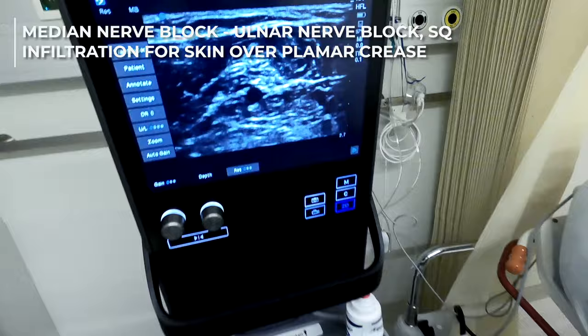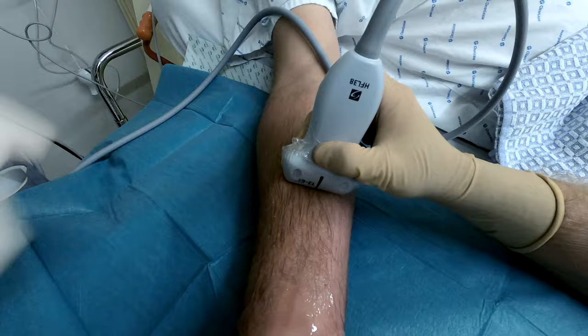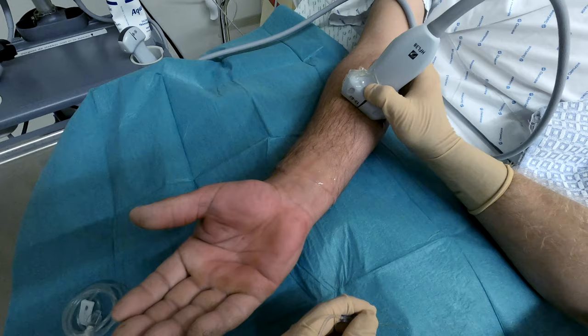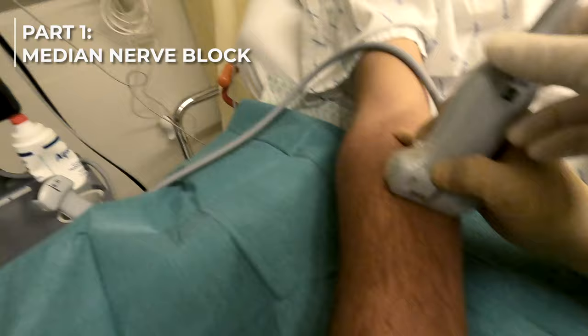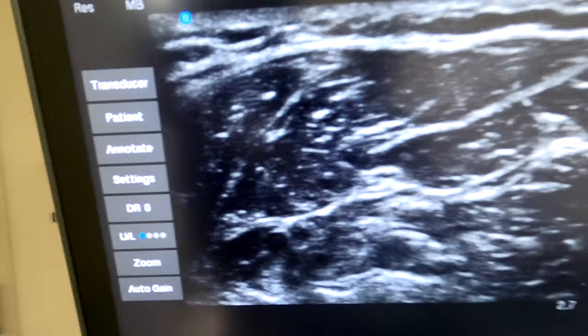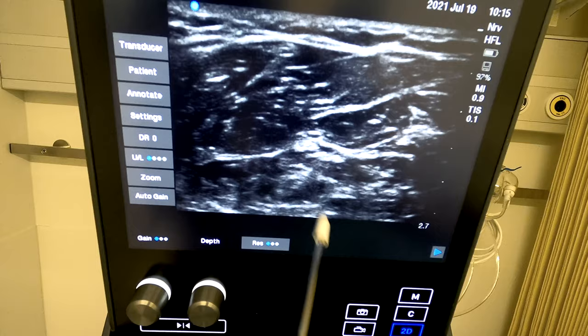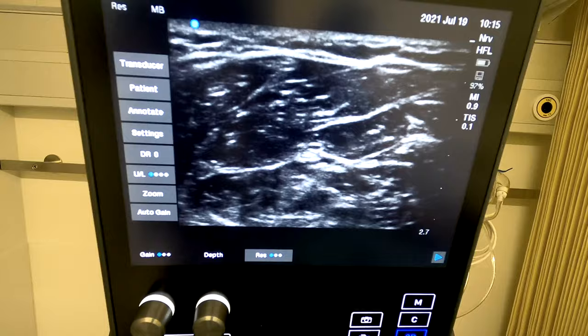The first thing we are going to do is the median nerve block. We'll position the transducer in between the palmar crease and the ulnar crease, somewhere in the middle. We'll go a bit more distal — and now with a more distal approach there is a very nice view of the median nerve. We adjust slightly proximal or distal to get the best possible image. Our focus is really getting the best view of these fascial sheets — the superficial flexors and the deep flexors — because the injection occurs between those two tissue layers.